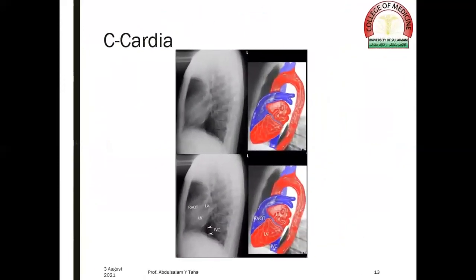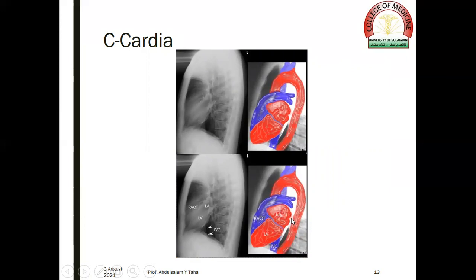There is a correlation between the anatomical and radiographic appearances on the lateral view. The right ventricle is located anteriorly, while the left atrium and left ventricle are located posteriorly. Therefore, an enlargement of the left atrium may compress the oesophagus.